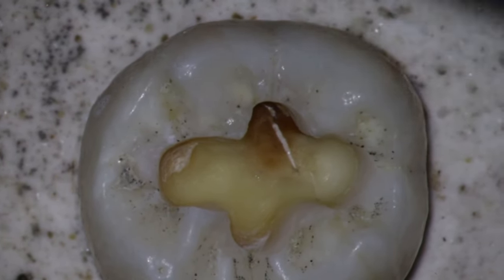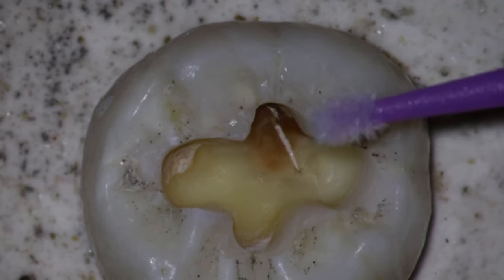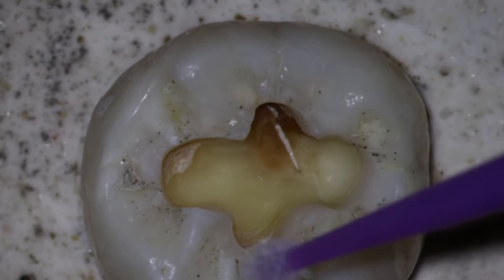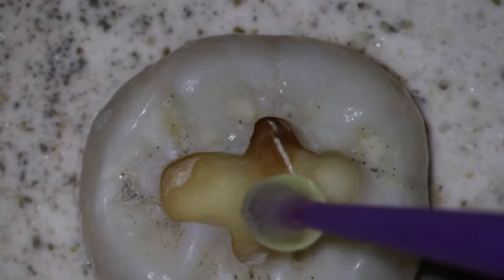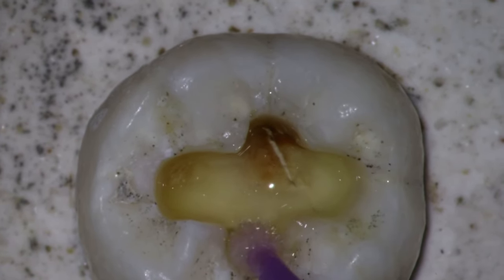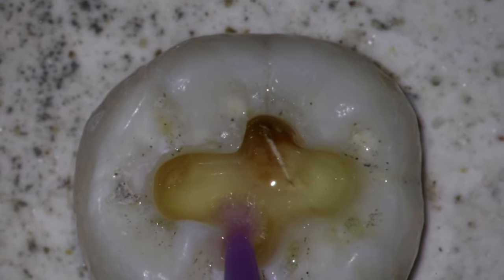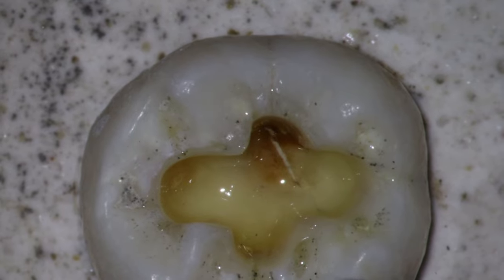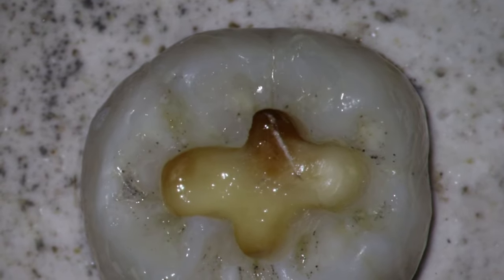So you take the applicator tip, this is called as an applicator tip. You can see the bristles, they are very small. So they apply the bonding agent very nicely all over the tooth surface. So you take a drop of the bonding agent, then you apply it everywhere. You apply it everywhere on the tooth. You have to rub it properly. You have to blow the air so that you remove the excess bonding.